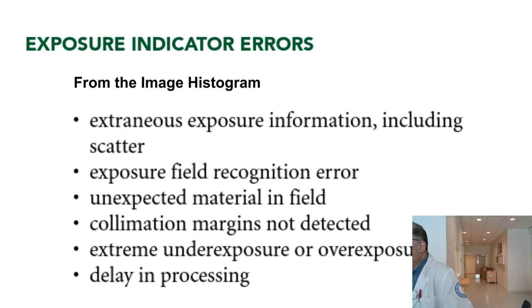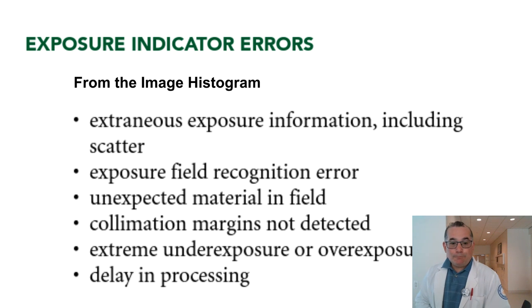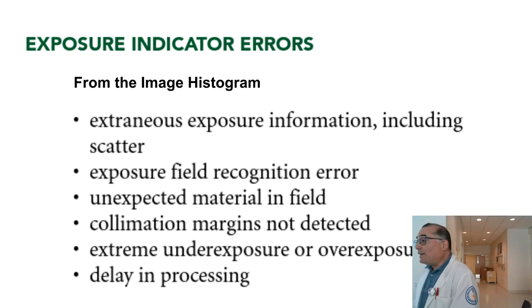It's basically the last CR process. The last step is that the phosphor is exposed to a very bright light, right? To kind of reset all of the molecules within the phosphor. But we're trying to somewhat duplicate that by just taking a long time to process the image, because ultimately the lights here will erase parts of the image. So we'll see what Jody Ann gives us soon. Maybe we'll know today.